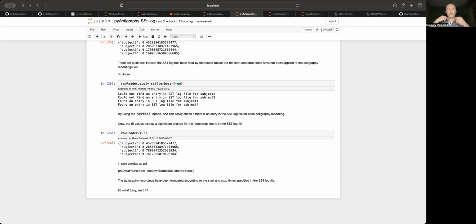That's something that we should do, or at least have guidelines on for the different devices, like tuning the different algorithms, because they always have input parameters that we can tweak. So it's really difficult at the moment. There is no good answer, in my opinion, out there. So maybe that's something that should be developed, a pipeline to help people tune to their own population, or at least provide guidelines. Okay.